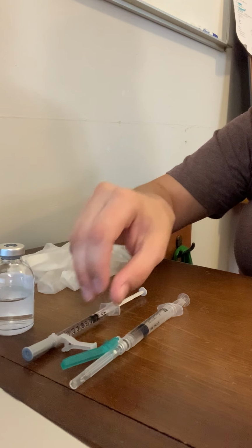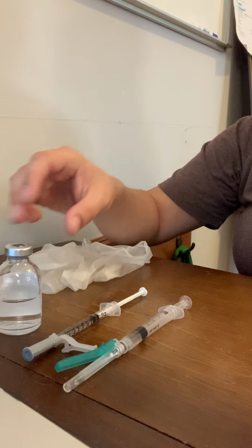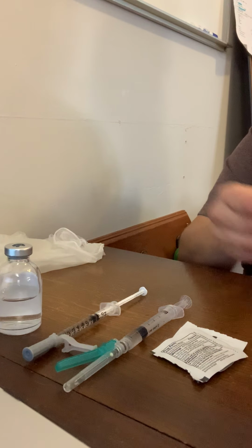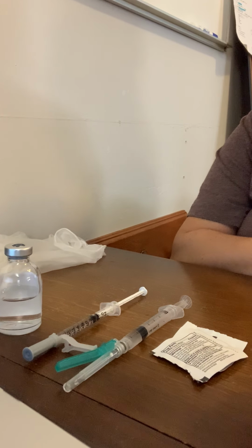I've got my syringes and my needles. I have my 2 medication vials. I've got my alcohol prep. And I've got my gloves. I have my physician's orders. And I've got my MAR. Okay, so I'm going to head to the patient's room.